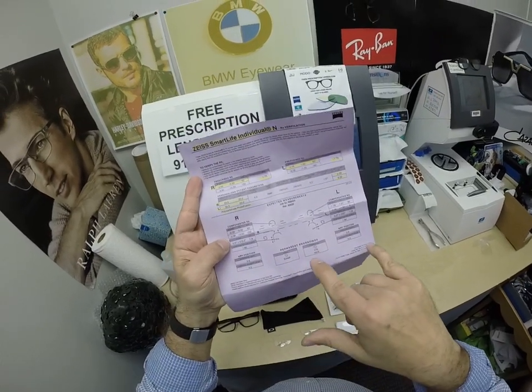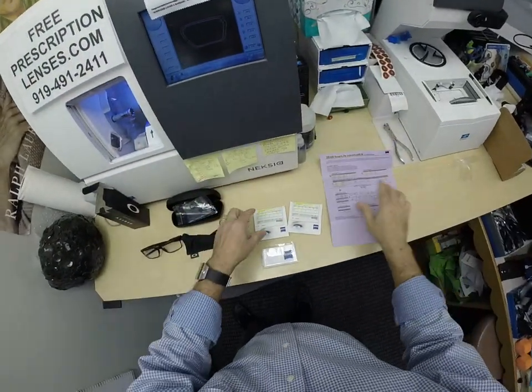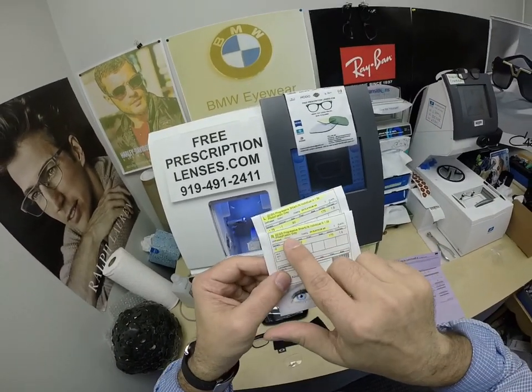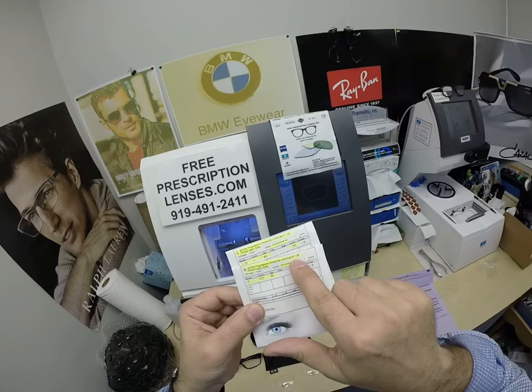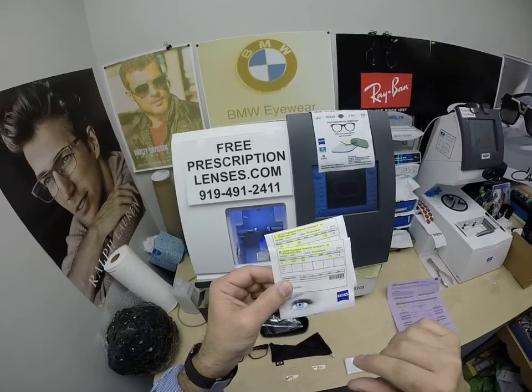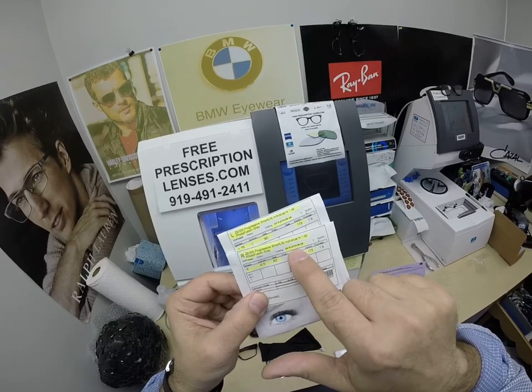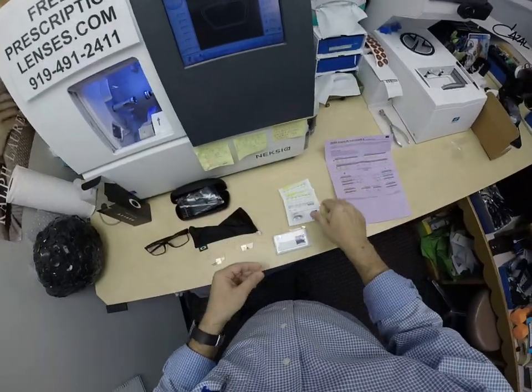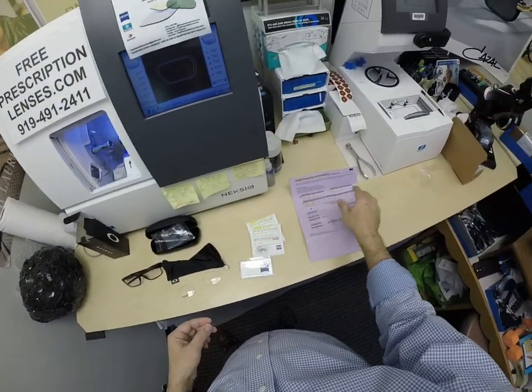The laser engravings in the lenses show where to find those powers. You're also going to get everything from Zeiss. And again, this is the progressive Smart Life Individual. N stands for near — I'll get to that. 1.59 is the refractive index of polycarbonate, Photofusion Gray, DuraVision Platinum. I've highlighted the prescription for the right eye, add power, same for the left. And of course, the Zeiss cleaning cloth.